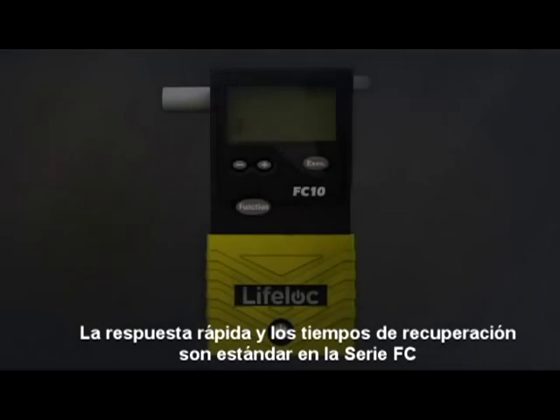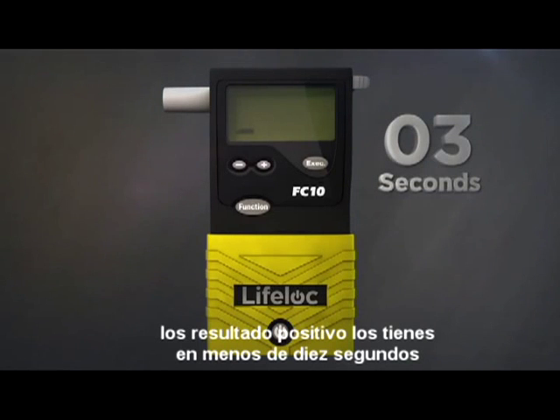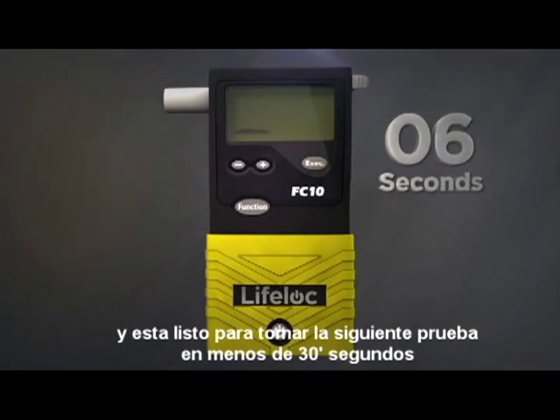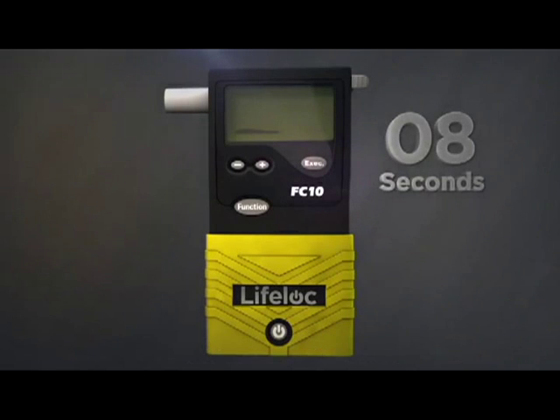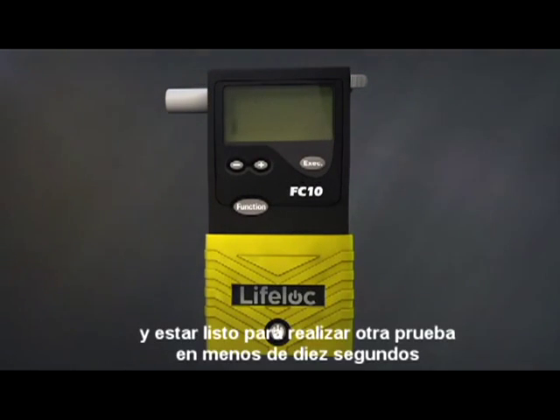Fast response and recovery times are standard on the FC Series. Positive test results take less than 10 seconds and you're ready to test again in less than 30 seconds. Get instant results on negative tests and be ready to test again in under 10 seconds.